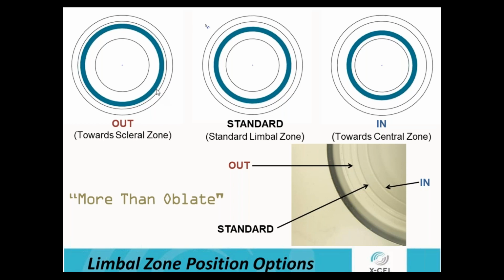And then just the opposite, if I have a PMD patient, sometimes a cone patient, and the steepest part of that is out towards the edge, I can now move that highest point out to the edge. You only have 3 options, one in or one out, and it goes a millimeter in towards the center or out towards the edge. I do have a question.